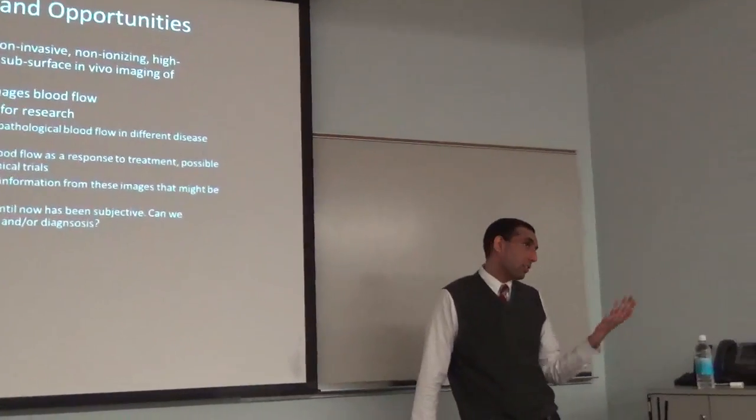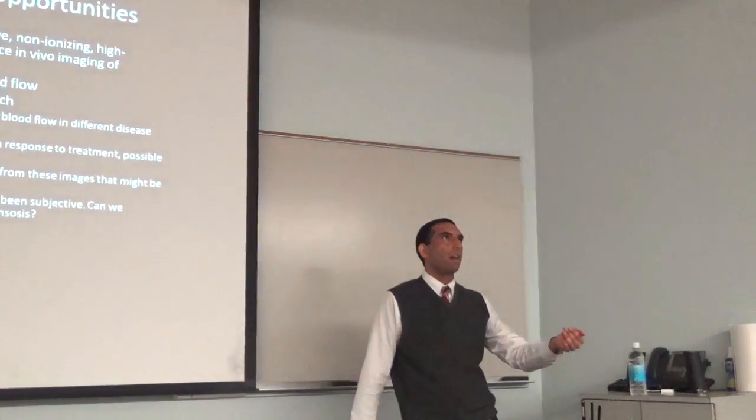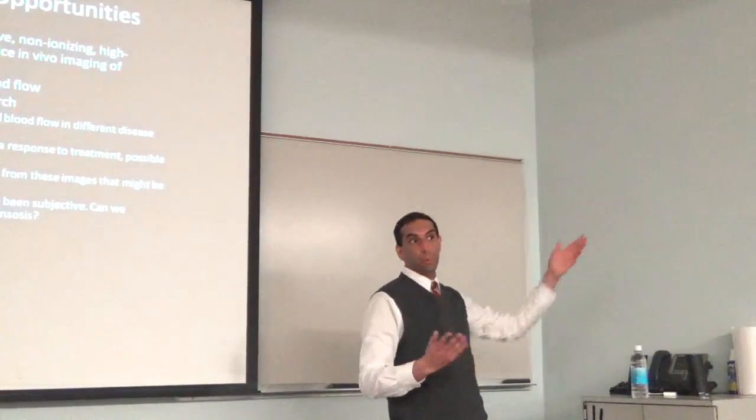Does this work similar to a CT scan where you can vary the linear depth at which you're getting in? Like, can you get multiple slices, or is it just of one? Right. So the answer to the question is yes. However, we're limited by the scattering of non-ionizing light. So we can really only get a depth of maybe a millimeter, so 1,000 microns. Whereas a CT scan, you can get a CT all the way through someone's head, right?